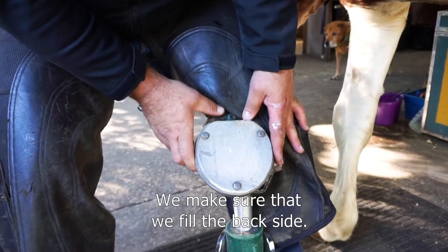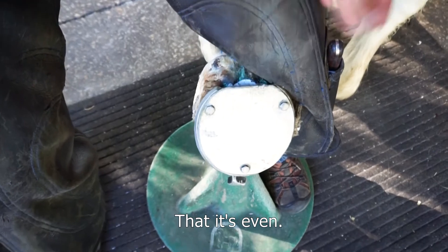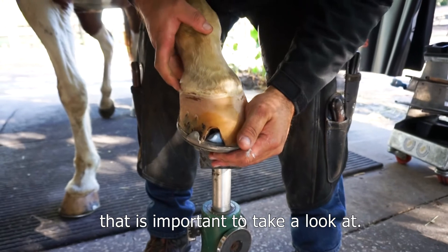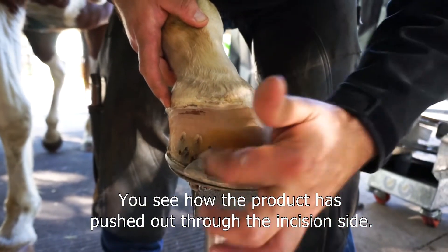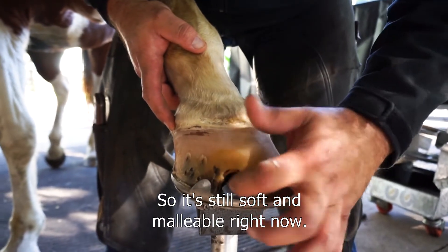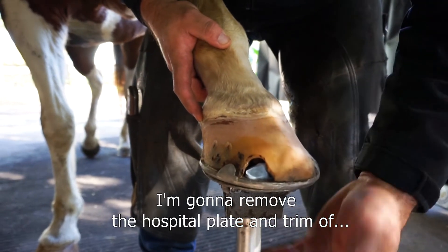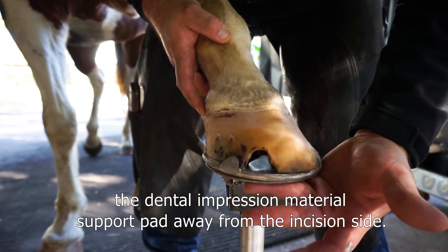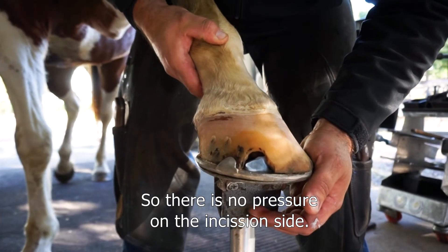We make sure that we fill the back side is even. The other thing that's important to take a look at — you can see how the product has pushed out through the incision site. Once it's done setting and curing, I'm going to remove the hospital plate and trim the dental impression material support pad away from the incision site so there's no pressure on it.